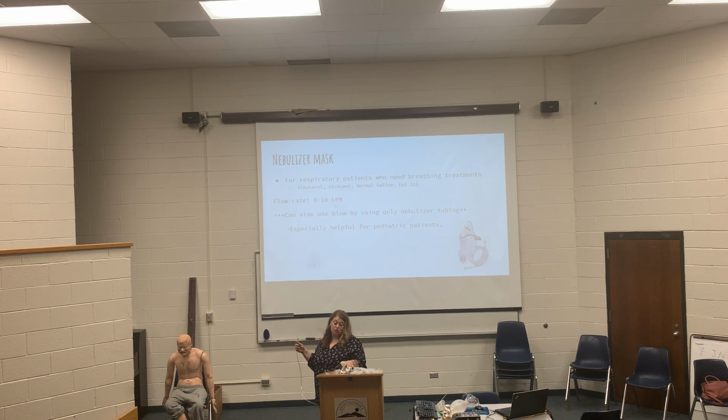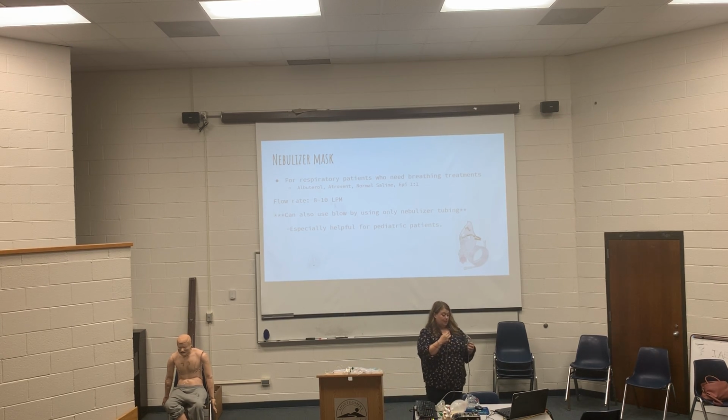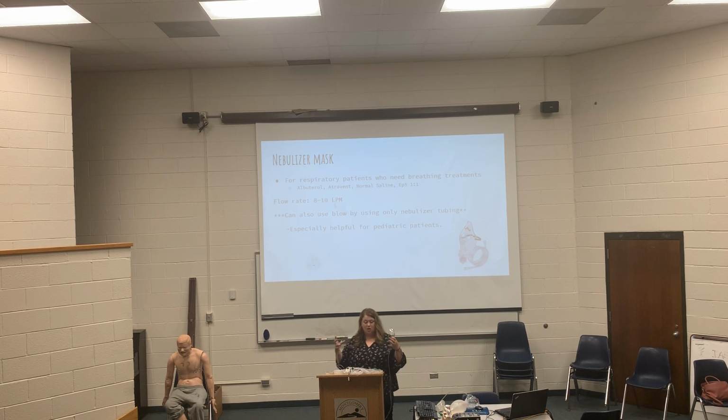Now, if you choose to let them use the mask, which is what I recommend, all you have to do is pop that mask on there and it will aerosol out. We'll get into that probably next class. And again, make sure it's over their ears. They're gonna wanna talk during it. Tell them to take a deep breath, try to get all that medicine in. And eventually, what it does is it opens up the bronchioles. It's a bronchodilator, so it helps them breathe better.